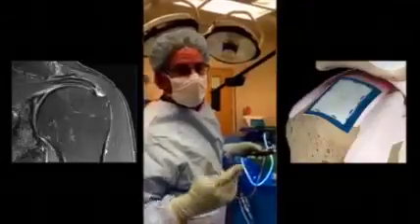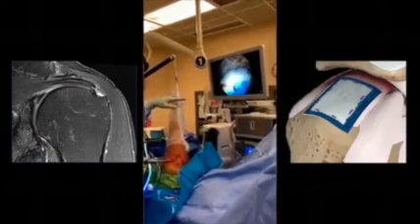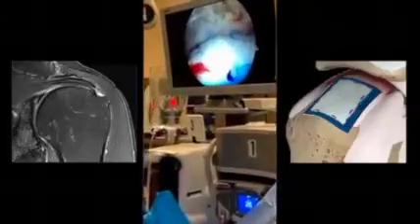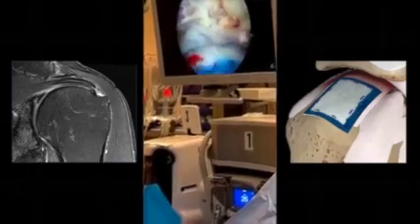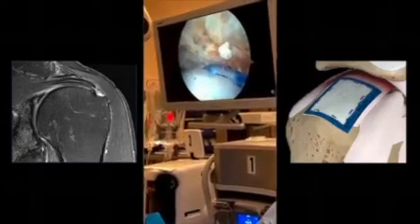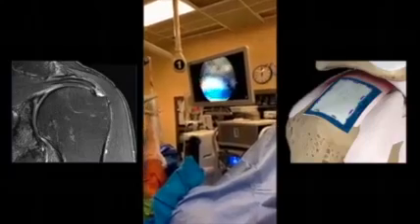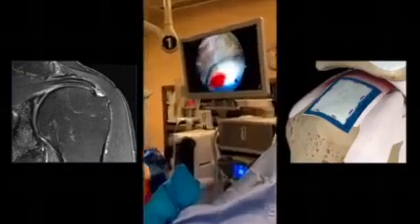All right. Okay, so awesome. So check this out, guys. We saw the before, and you saw how we debrided everything. And now here's the Regeneten patch laying over top of that high-grade partial tear of the rotator cuff. And look how sweet this is. So that impingement or pinching sensation she was having is going to be gone immediately. And I think that's a big reason why these patients get immediate pain relief. You can also see how visually appealing this is when this patch or implant goes over top of the pathology.